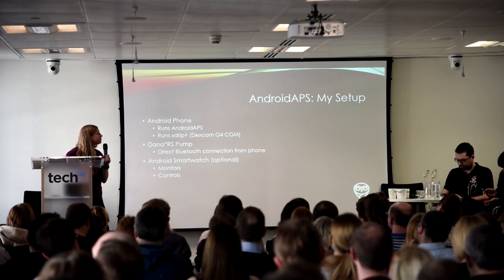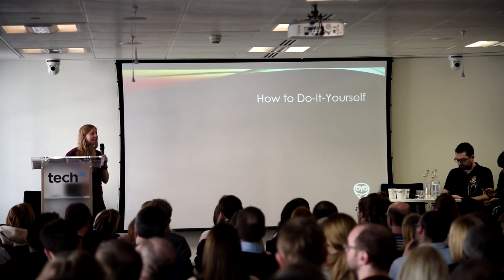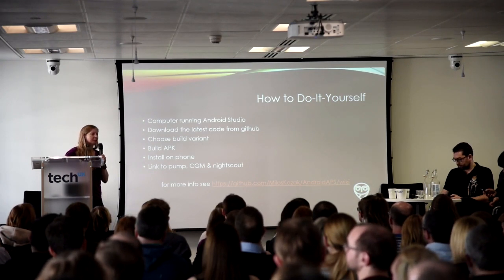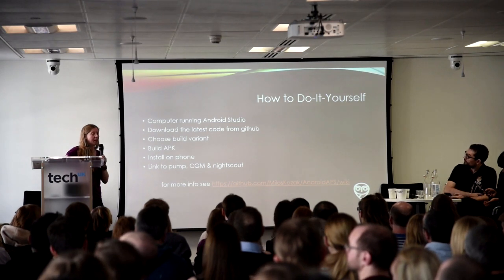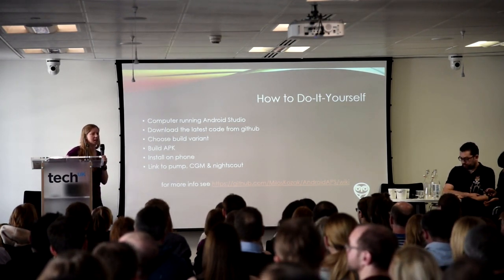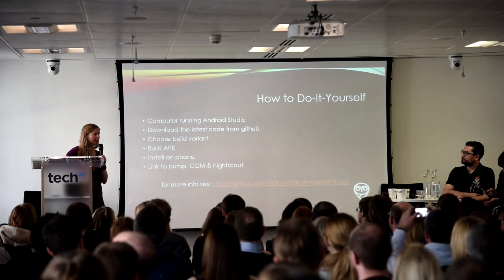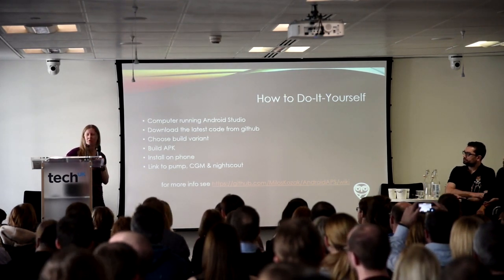How to do it yourself is actually surprisingly simple. I'm not a coder, as I said. I don't do computers. But there's just a few steps you need to follow. There's a user guide. Go through it step by step. If you've got a decent computer, and if you understand a bit about coding, you can get it done in less than 20 minutes. If you've got a slower computer, and you're not too sure what you're doing, but you follow the steps, and you ask online if you need help, and someone replies pretty quickly, it'll take you about 2 to 3 hours.